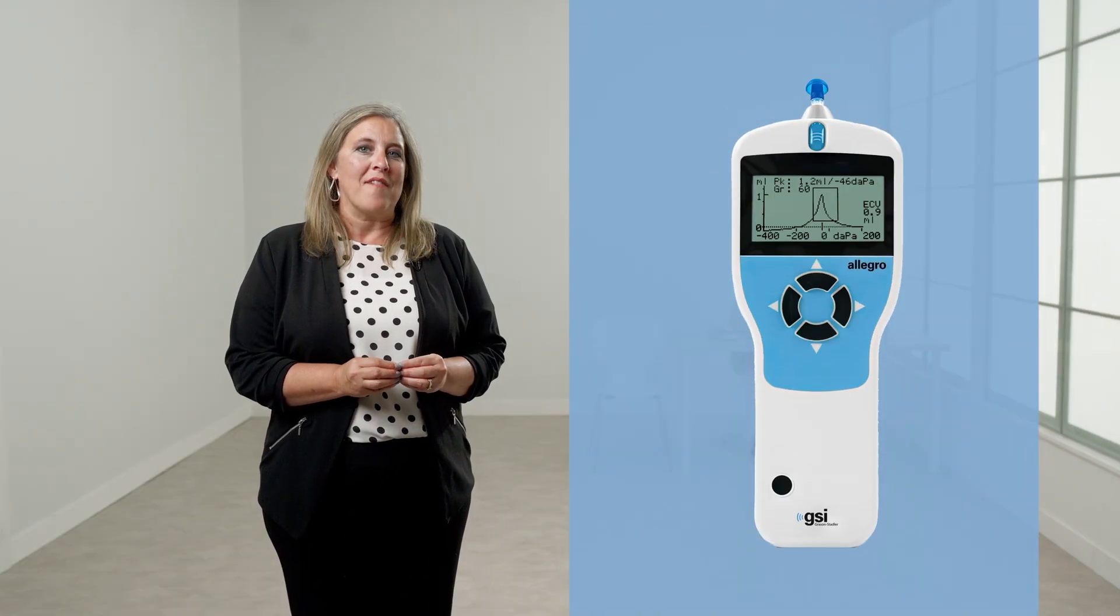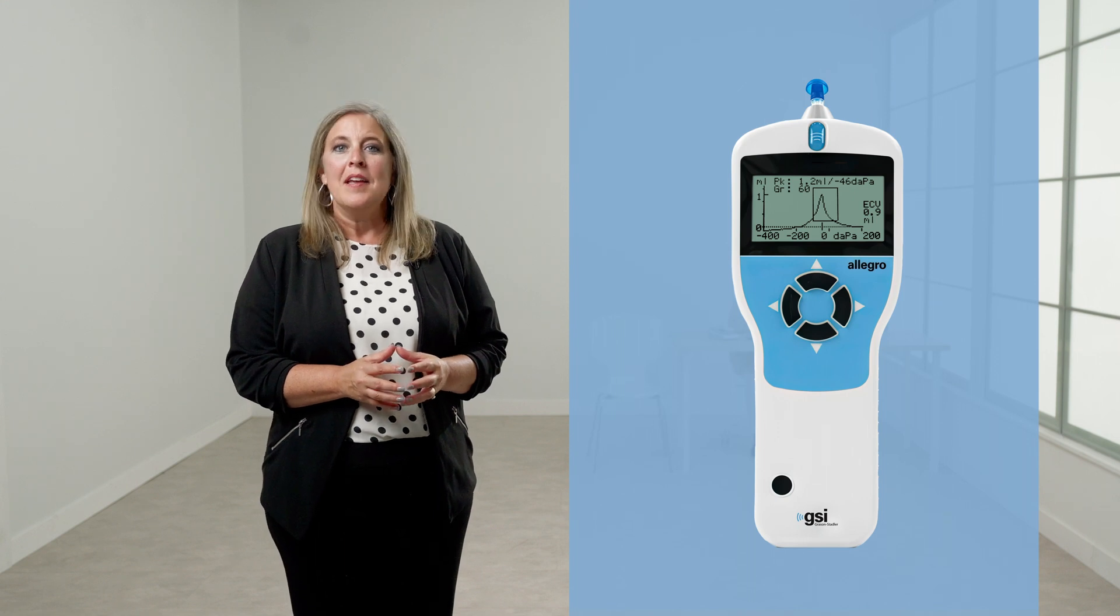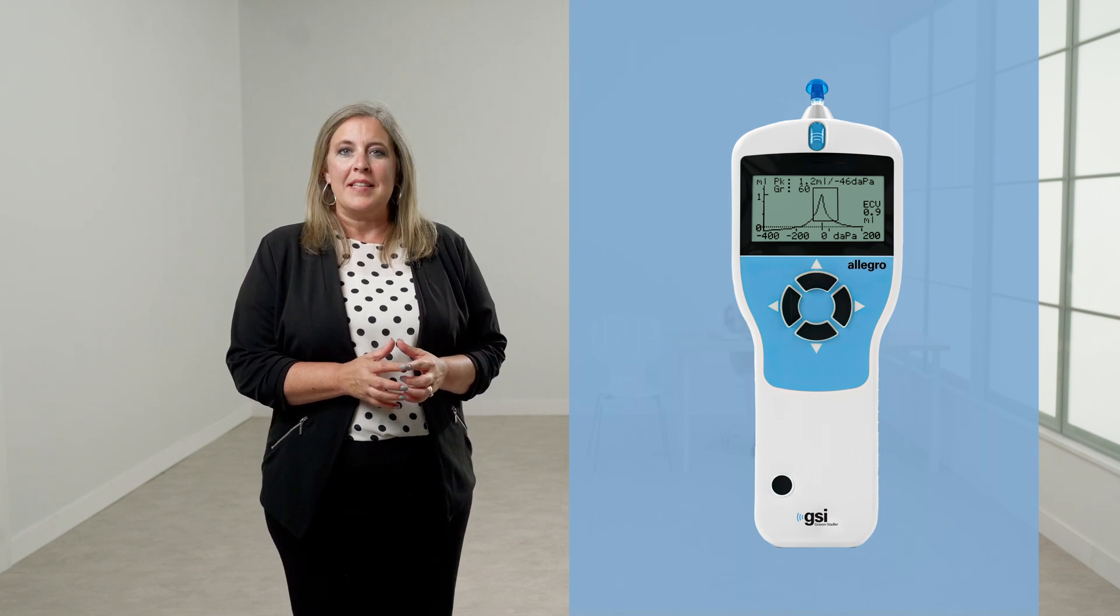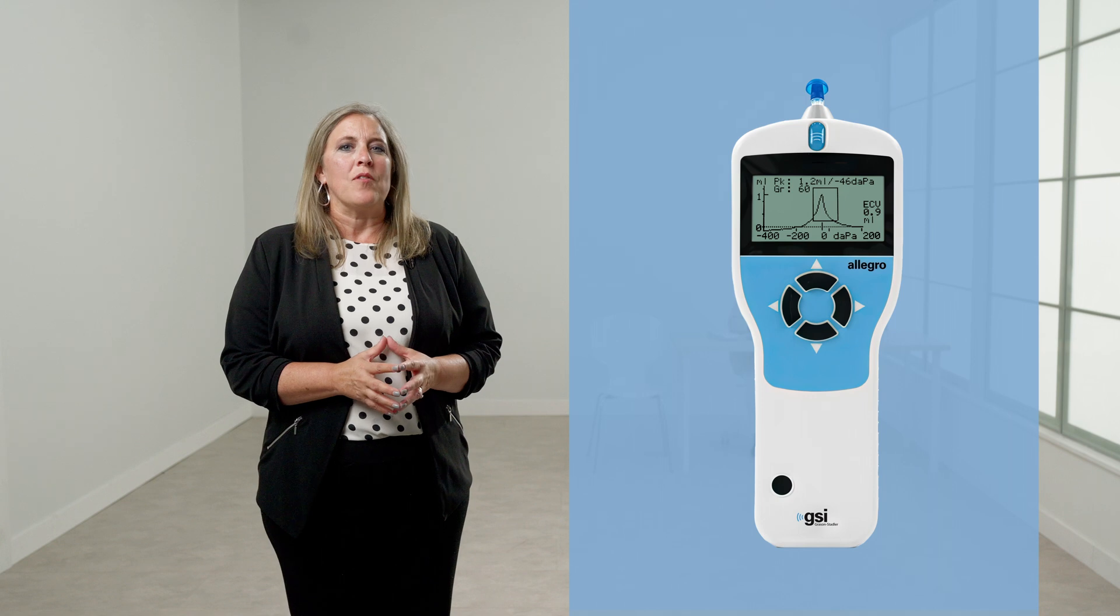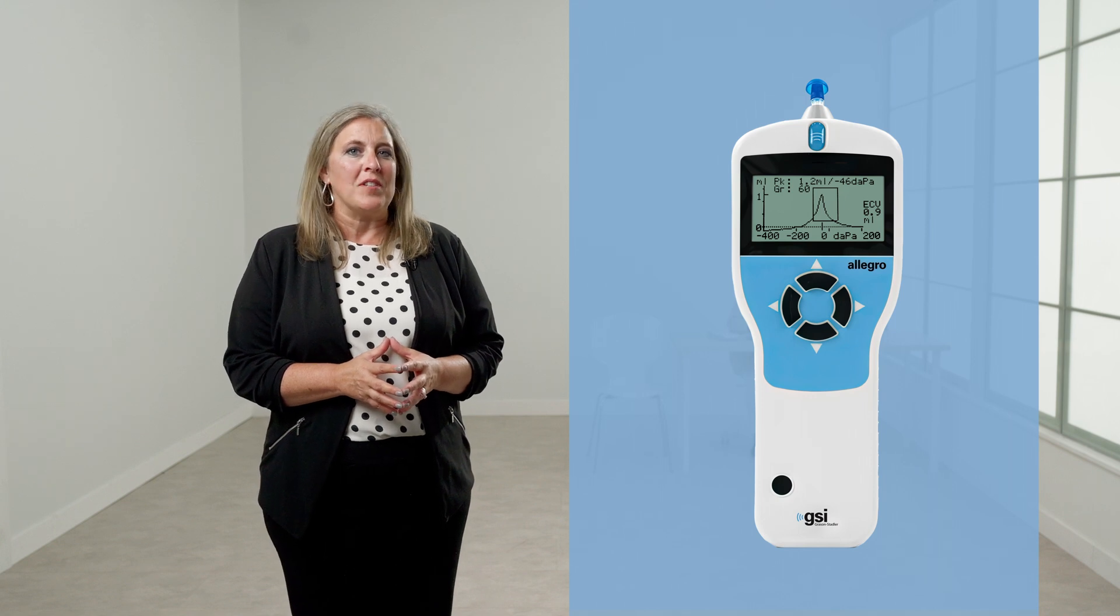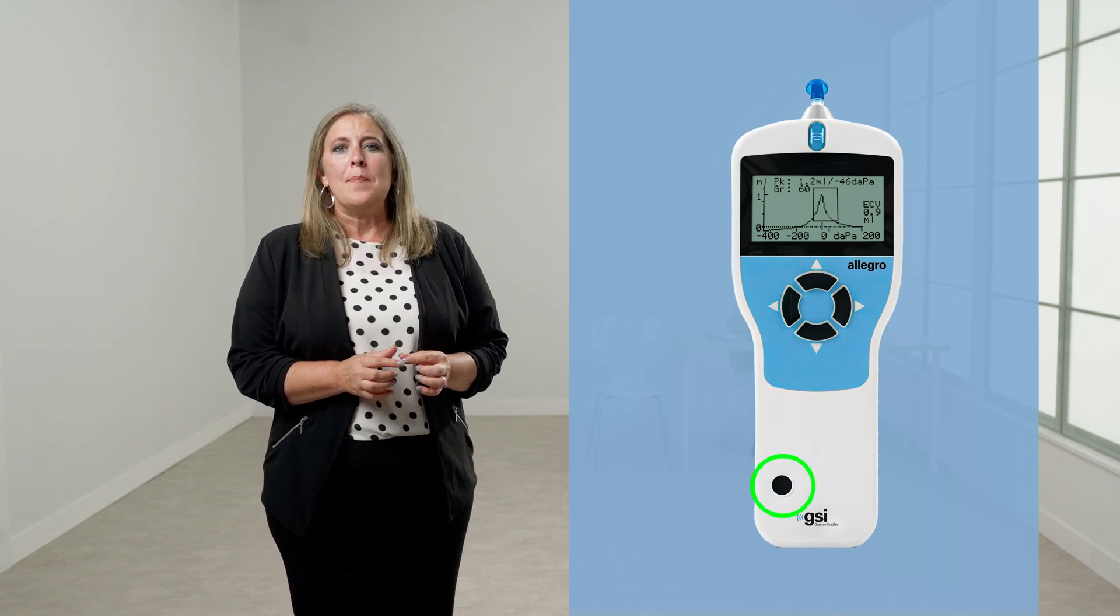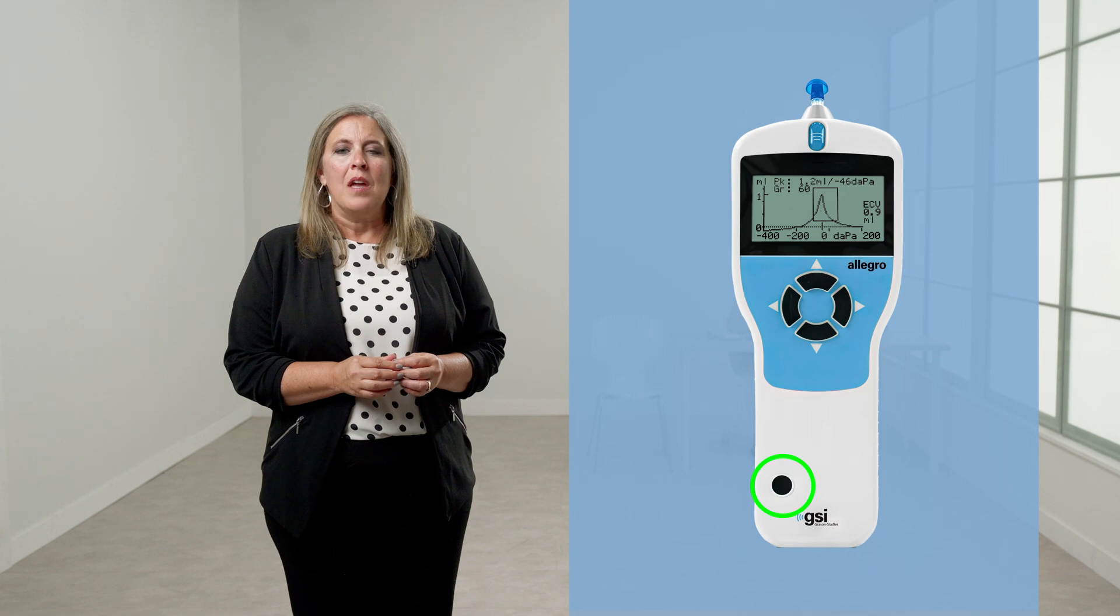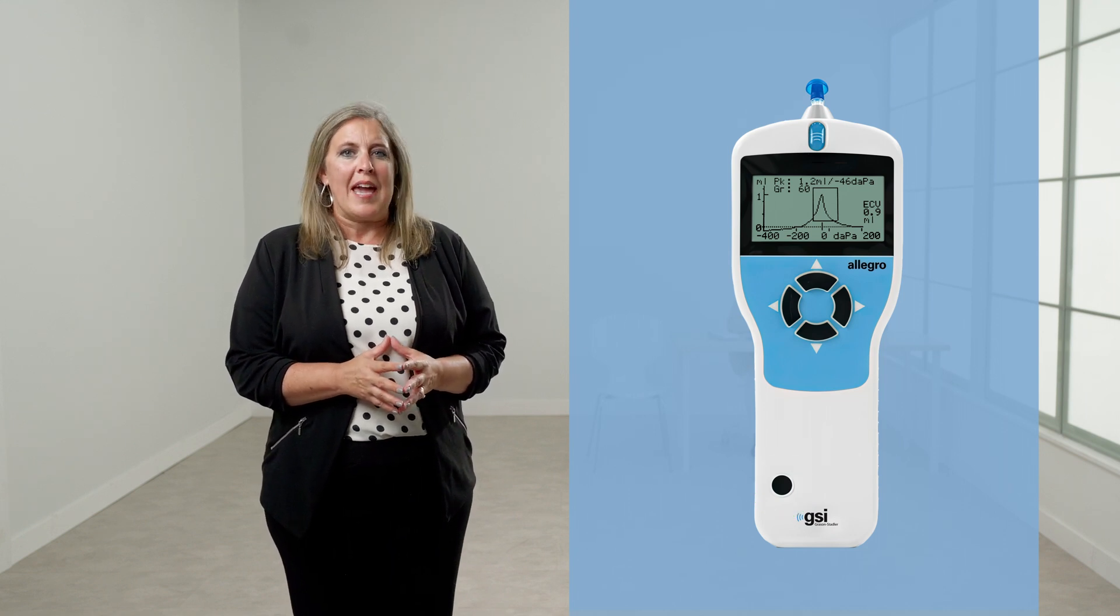The Allegro handheld instrument consists of four navigation buttons and a power button. The LED screen displays testing information as well as information that is accessed in the menu for setting defaults. Press the power button to turn on the Allegro. There will be a short diagnostic check and the pump will engage.